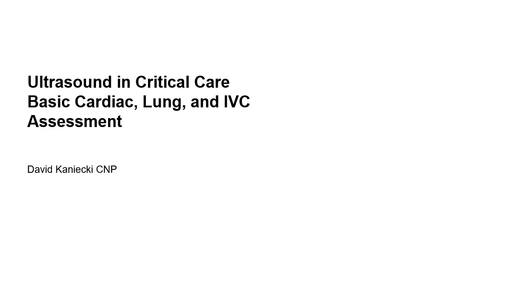Welcome to the basic cardiac, lung, inferior vena cava assessment with ultrasound presentation. Real-time ultrasound use as a diagnostic tool has revolutionized the way we approach and manage critically ill patients, and we are thrilled to share this knowledge with you.